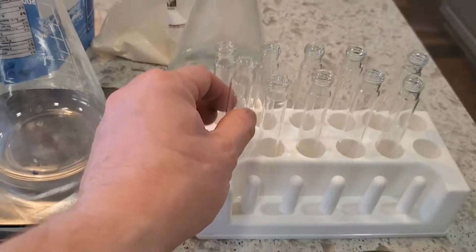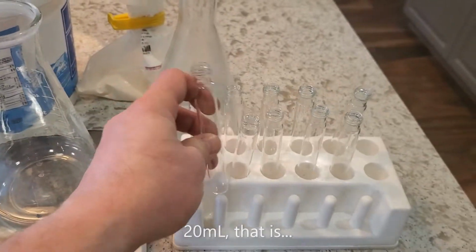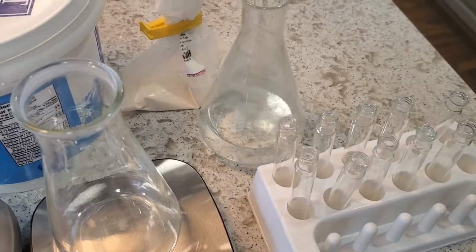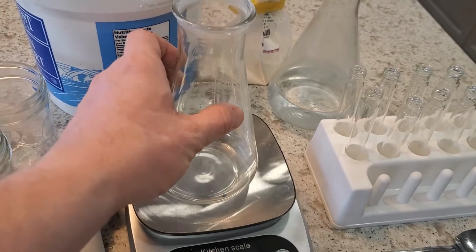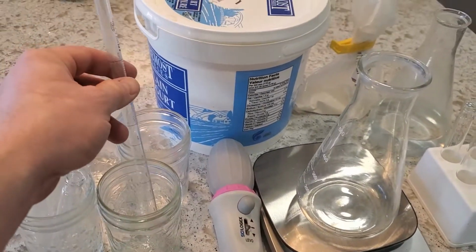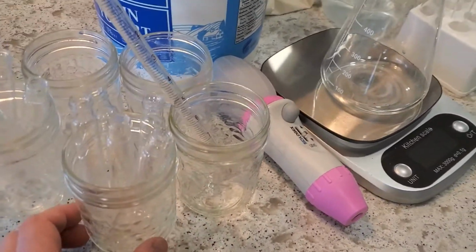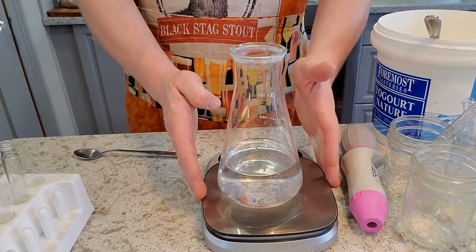So for this, I'm going to be using these vials here. These are, I believe, 25 ml vials. And you can see here that I've just got a nice little rack for them that I use when I'm filling them up. I'm going to be using just filtered water, of course, just so we don't have any chlorine or chloramine issues. I've got some dried malt extract in here, some yeast nutrient, a flask that I'm going to use just to get everything dissolved in solution. I've got an auto pipette here so that I can fill these vials up, a couple of spoons, a nice accurate scale, and I've got some mason jars that I'm going to use when I pressure can them in, of course, my pressure canner. So the first part of this process is actually just making the wort.